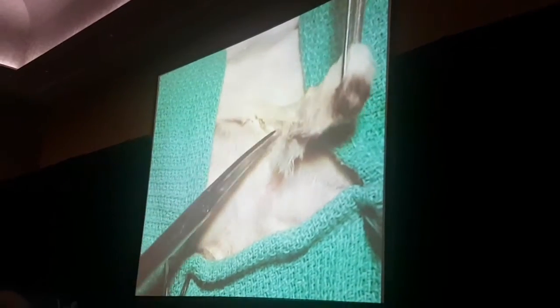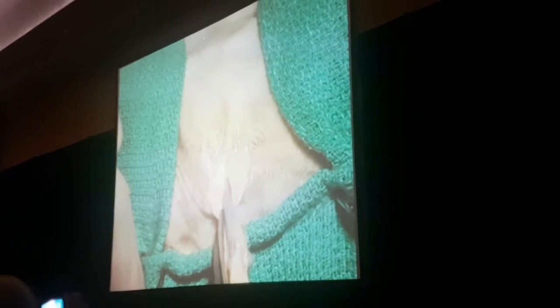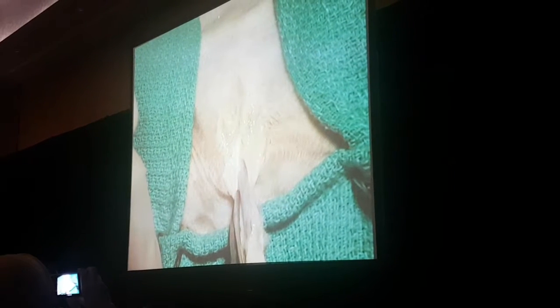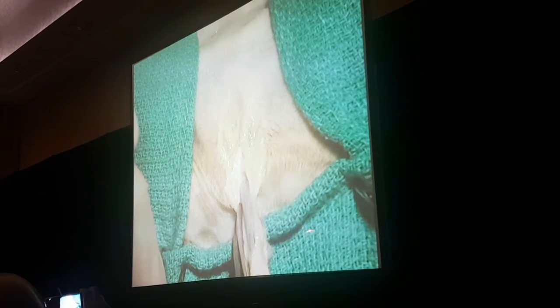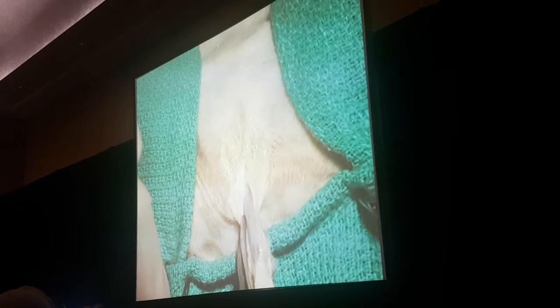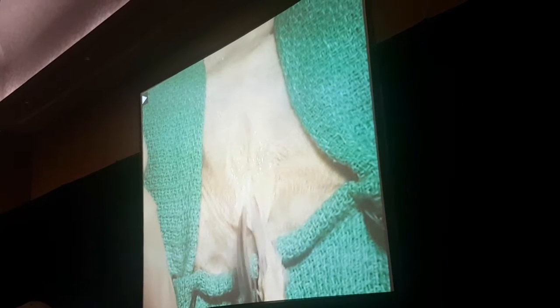He takes you off of his penis because you have to see his anatomy, and you need to see the anatomy of his penis so that you can identify the different structures. What I've done now is I've taken his penis and I've pulled it caudally, so his penis is being pulled towards the caudal aspect of his body, and I'm going to do his ventral dissection.